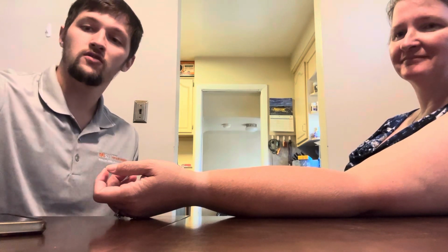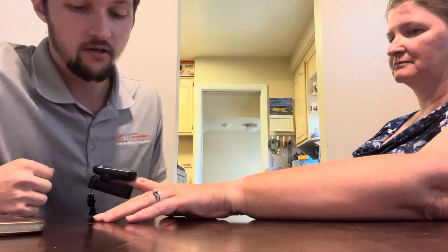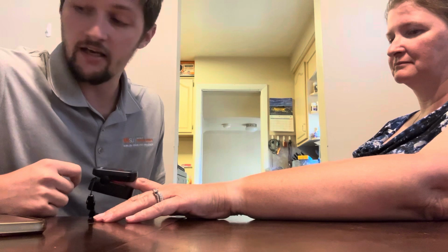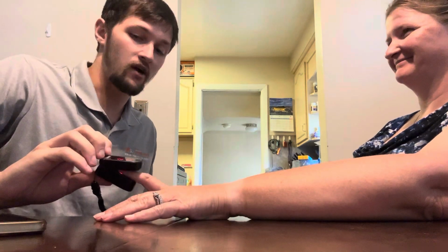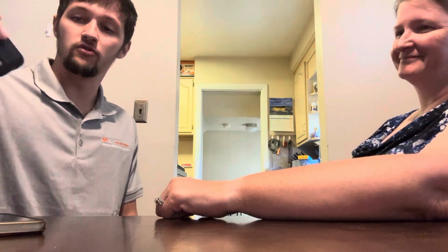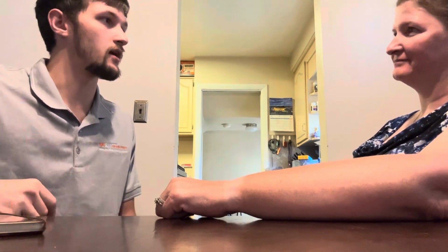So the next test we're going to do is the oxygen saturation test. So this basically tests how much oxygen is getting to your blood, which then fuels your tissues. So if you have a low oxygen saturation, which yours is 98, so that falls into the normal percentile. So your oxygen is getting to your blood correctly, and your beats per minute was around 76, which is around where I got on the pulse test.